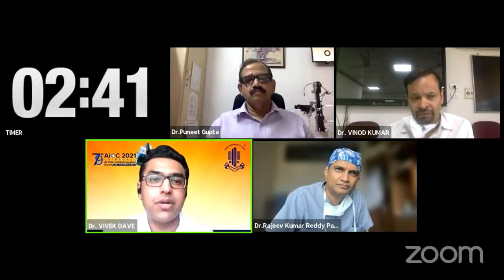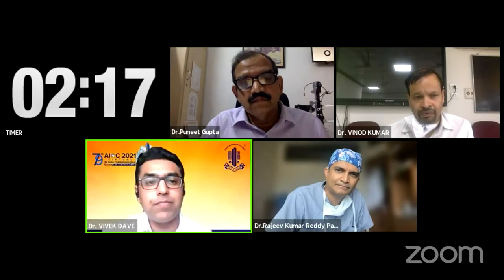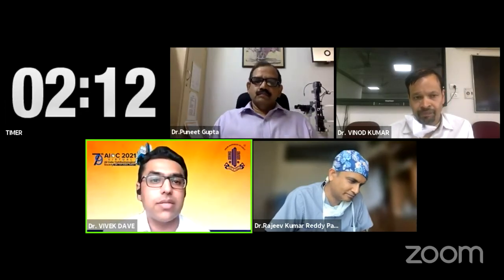This particular case, the third case that I showed, the B scan actually looks very bad, but having gone inside, once the anterior vitreous was cleared, the posterior segment hardly had any exudate. So I think this is again a standalone important application of endoscope where you can quickly go in and try and assess the viability of the eye so that you know to which way your resources need directed. From that point of view, I think B scan is relatively subjective, and endoscope takes away a lot of that subjectivity because it gives you a direct visualization.